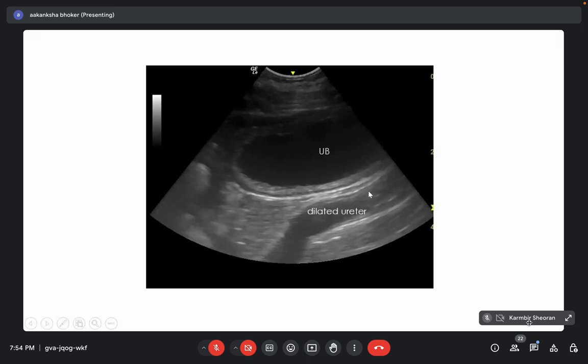How can we differentiate the aorta or caudal vena cava? When we apply color Doppler, there will be blood flow in it. And if there is no color Doppler facility available, then we can check for the pulsatile nature of the aorta.